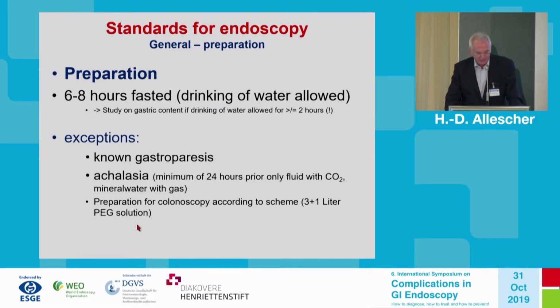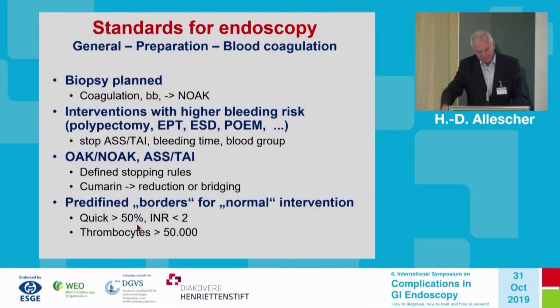Then there should be a standard for the endoscopy itself. So for the preparations, what does fasted mean? Fasted means no food, but drinking should be allowed, even up to two hours before the procedure. And there should be some exceptions which should be defined, such as gastroparesis or achalasia, where you should have a defined preparation process.